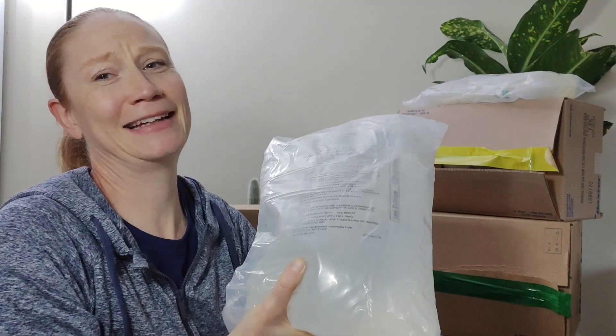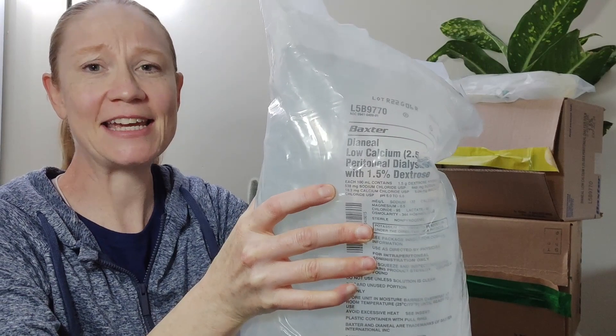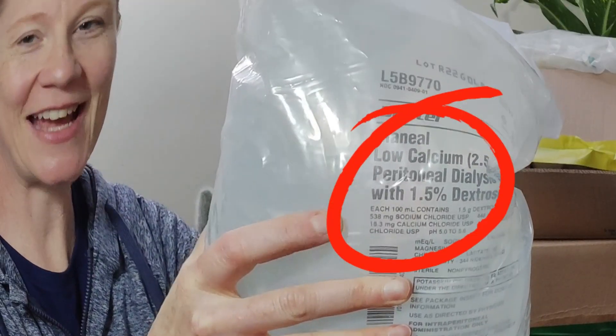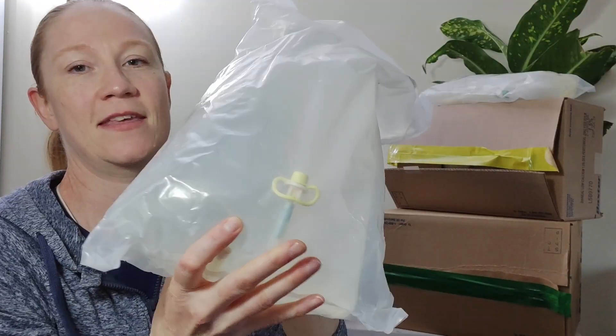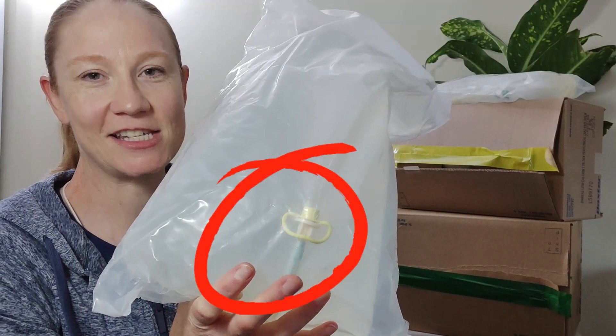The last bag I'm going to show you is from the Cycler, and it is a much bigger bag. You can see here that this is a 1.5% dextrose, and it should have a yellow seal. You can see right here — it's yellow.